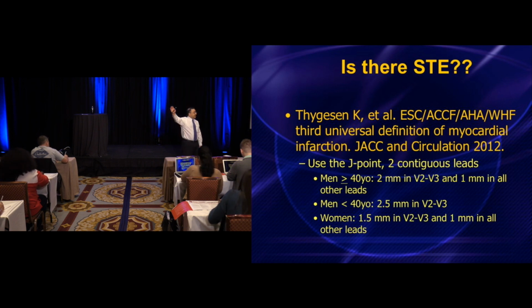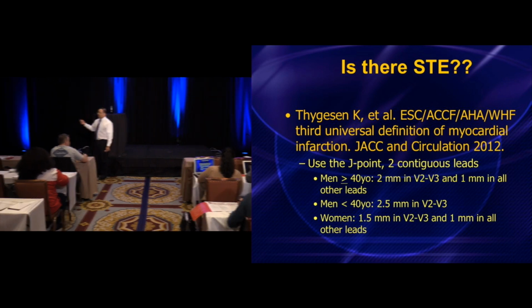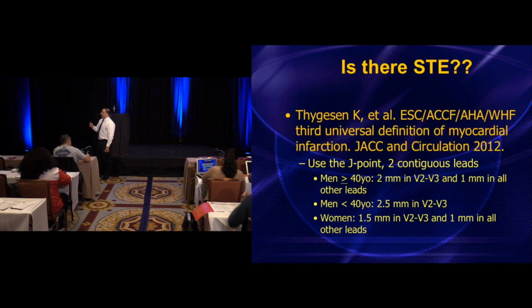Yeah, this really hasn't gotten out there, even at the board review courses. And in the textbooks, people don't talk about this. But this is how it's supposed to be defined. You'll occasionally see it in some of the cardiology textbooks and some of the newer texts in emergency medicine. But this is the formal definition based on what an international collaboration of mostly cardiologists have been saying for the past 10 years. And in the fourth universal definition, just recently published, same thing. In the US, the ACC-AHA STEMI guidelines, same thing, last published in 2013. So this is how it's supposed to be defined.